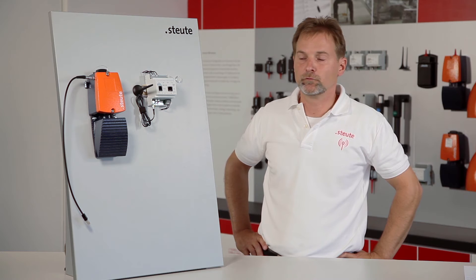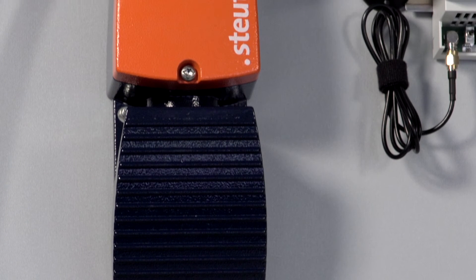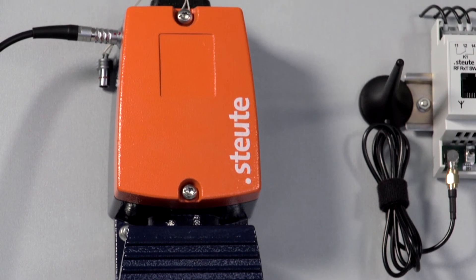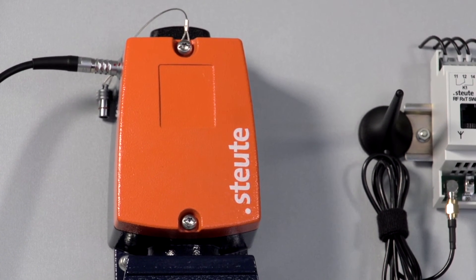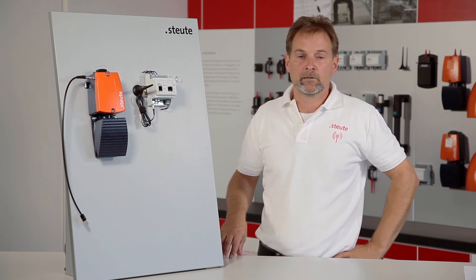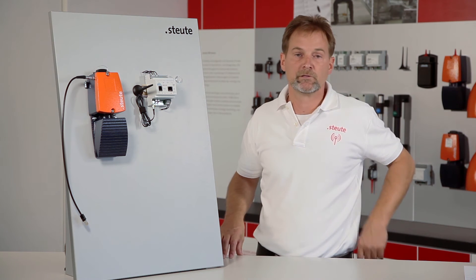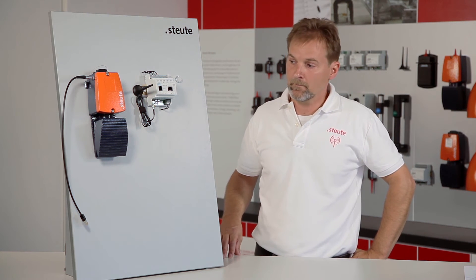I would like to show this on our wireless foot control. I should say at this point that the vertical installation you can see here is only for demonstration purposes. A sensor normally actuates an off signal once a certain angle has been reached, meaning that in practice the two components must be horizontal.